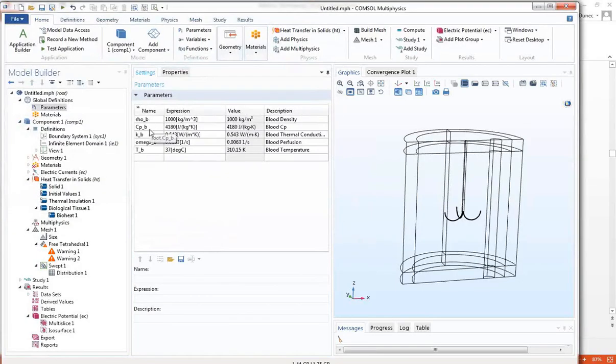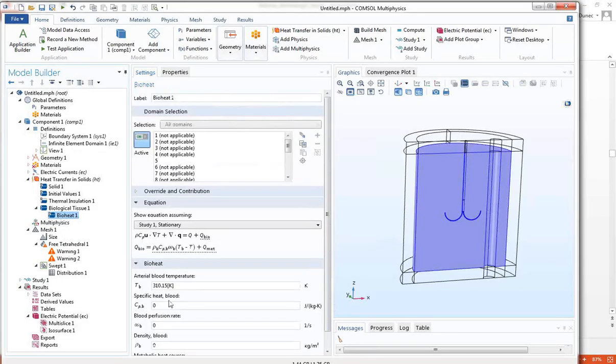So here they are. Okay, density, C sub P, the thermal conductivity, omega, which is the perfusion, the liters per second of capillary flow per liter of tissue, and then the blood temperature. So now let's go ahead and use those. So I'm going to go into Bioheat, and let's start typing these things in. So that one is T blood, T underscore B, and I've got to do the C sub P blood, so let me do that. C sub P underscore blood, okay, and the omega blood, omega underscore blood, okay, and the density of the blood, that's rho blood, rho underscore blood.